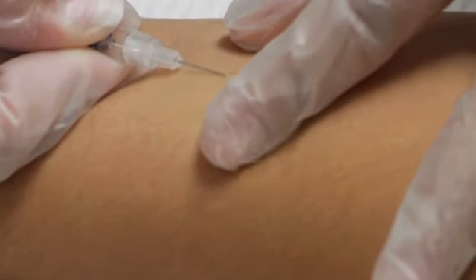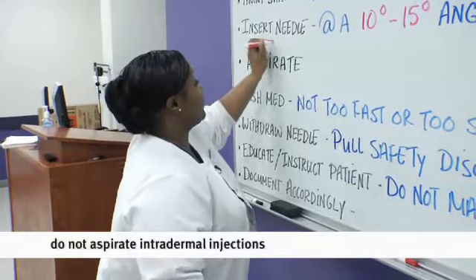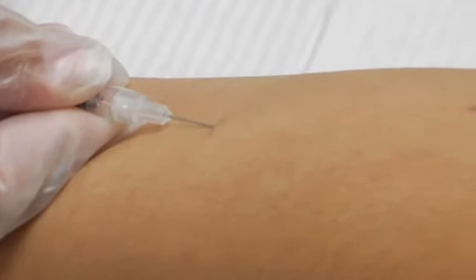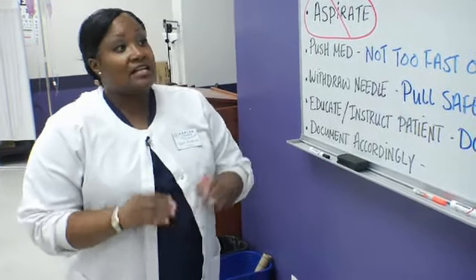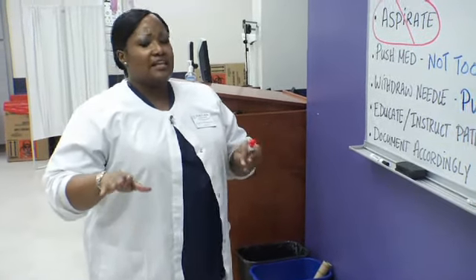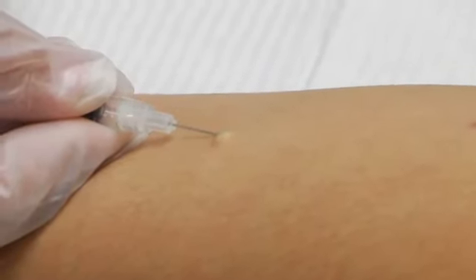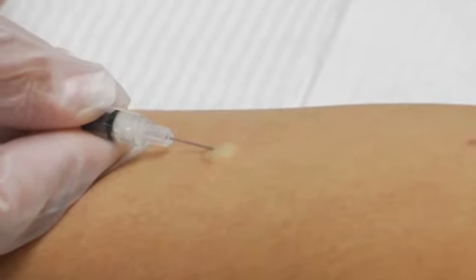Inserting to the skin now — hold the needle steady. Do you aspirate? Of course not — no aspiration. You do not aspirate with this injection because we don't go far enough into the muscle. This is the only parenteral route where you do not aspirate, because you're not going in deep enough to penetrate any blood vessel. Start injecting — push your medication not too fast, not too slow. If you can't figure out the pace, just count one, two, three. As you count, a wheal should materialize on the forearm. That is why people love this injection — because I know if I'm successful or not, because I will see the wheal. And it basically looks like a mosquito bite.